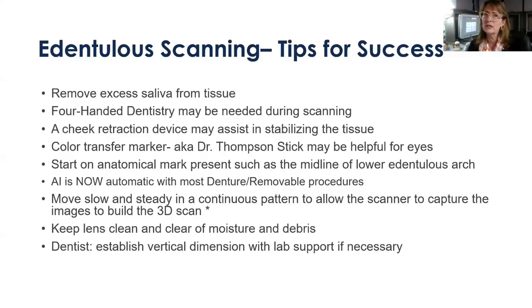Again, four-handed dentistry and cheek retraction devices may be helpful in being able to really see the tissue that you're trying to capture. I do like to mention something called a Dr. Thompson stick. It's a transfer marker. The iTero scanner scans off of topography, not necessarily off of color. So the Dr. Thompson stick is not for the scanner, it's for you, it's for me. It works well for my eyes, for my brain to digest the information.